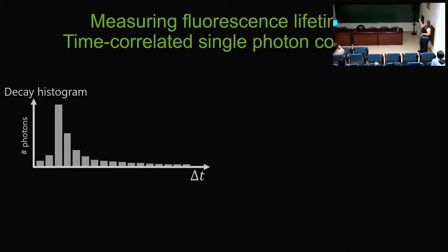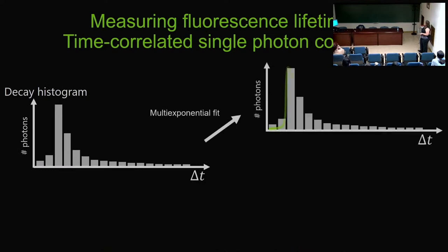for each pixel. You have a histogram in your image, and you can analyze that, for example, by fitting a multi-exponential decay. And often it's simplified beyond that into, in our case, a double exponential, and you can calculate a mean fluorescence lifetime, tau mean, and that is a weighted lifetime average. So A1 being the amount of that fluorescence lifetime contribution, and tau 1, for example, being the short lifetime contribution, tau 2 being the longer lifetime contribution in the exponential.